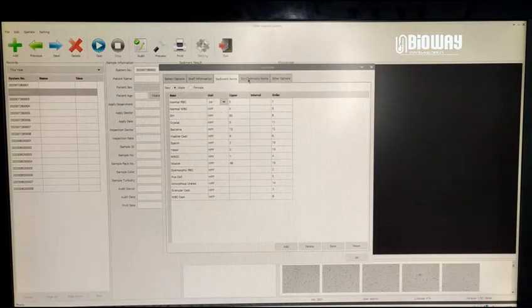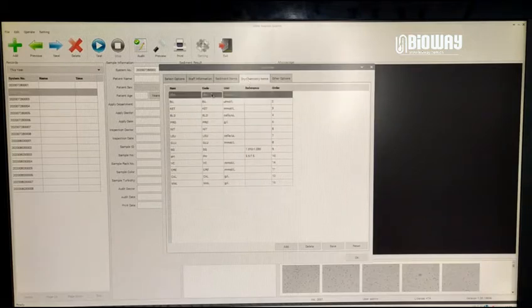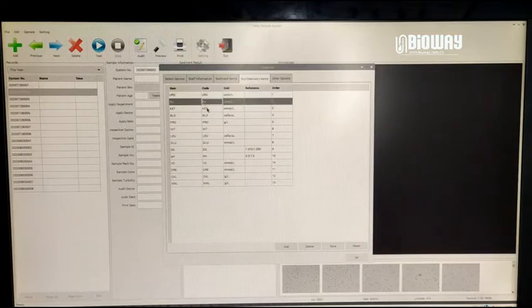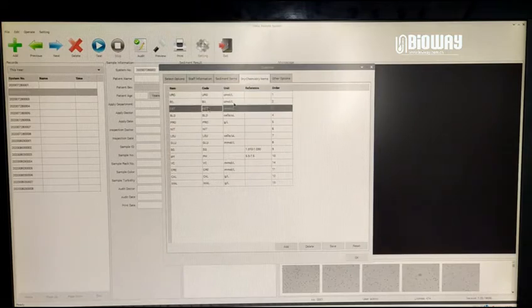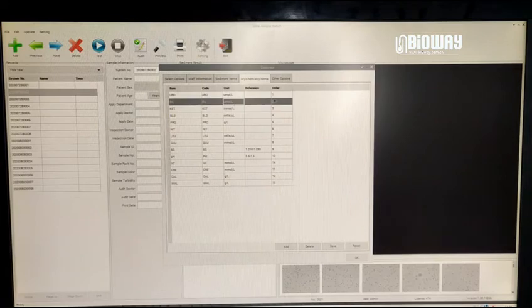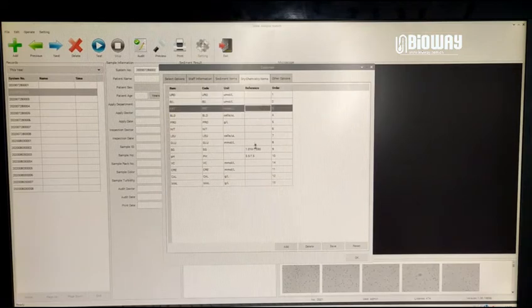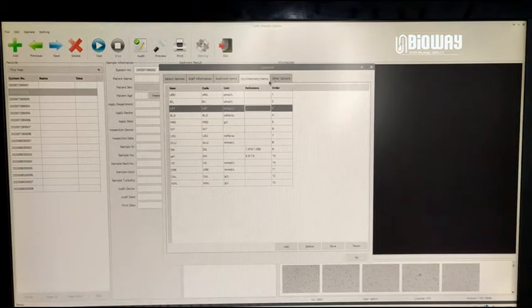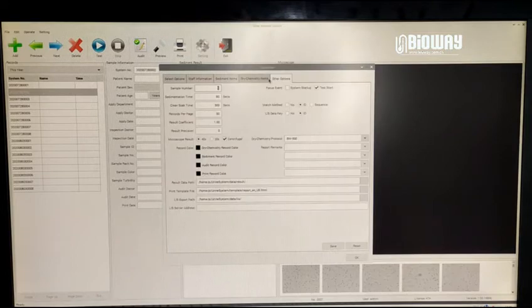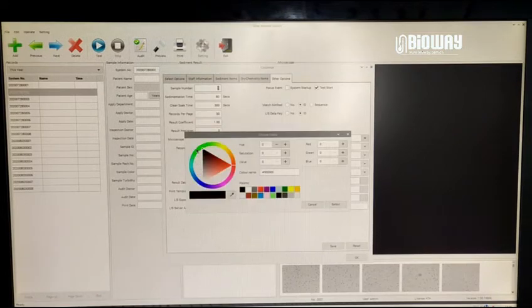The next is dry chemistry items. It is able to display the value from our urine chemistry analyzer, like BW200, 300, 500, or 901. Other options are set by default initial configurations, and you can change them if you need.